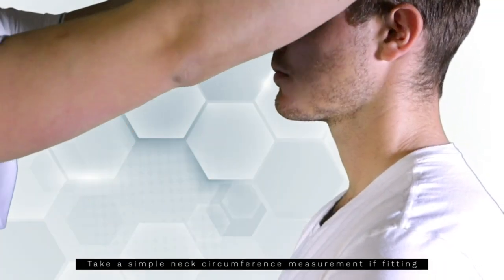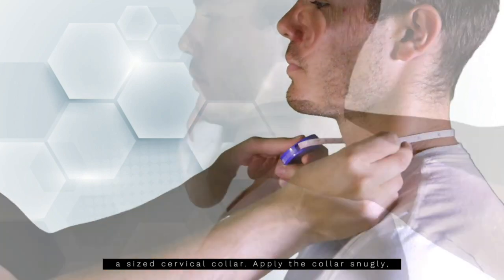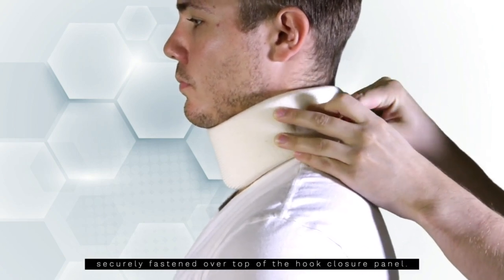Take a simple neck circumference measurement if fitting a sized cervical collar. Apply the collar snugly, making sure that the extended closure tab is securely fastened over top of the hook closure panel.